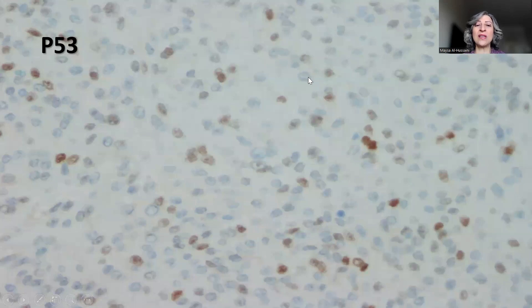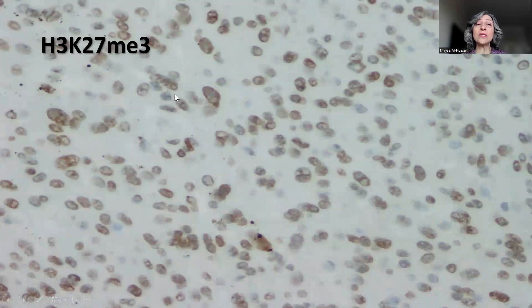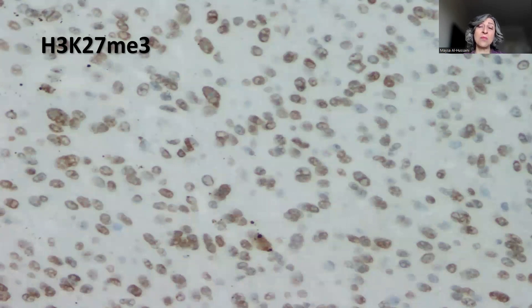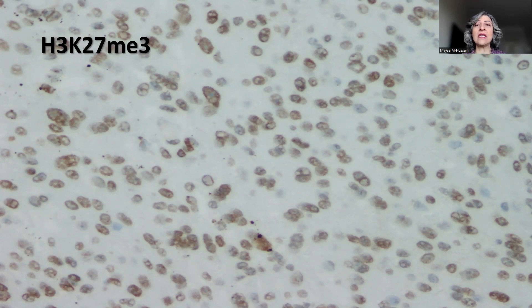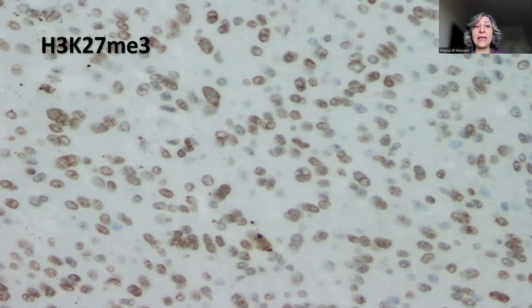P53 was not mutant or abnormal — it showed a mosaic pattern. Sometimes absence of H3K27 trimethylation staining is described in atypical meningioma, but in this case it was retained. My experience thus far performing this stain on atypical meningioma has not revealed any loss or absence of staining, though I have not done it on a large number of cases.